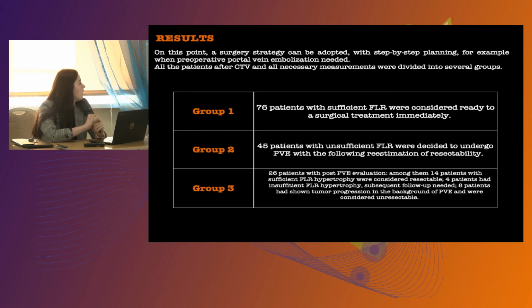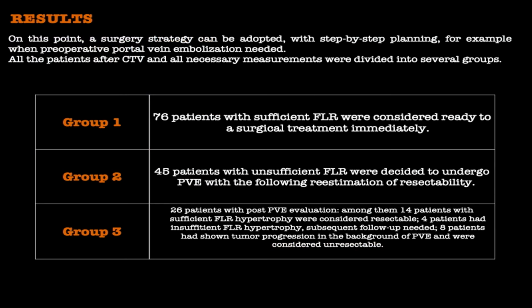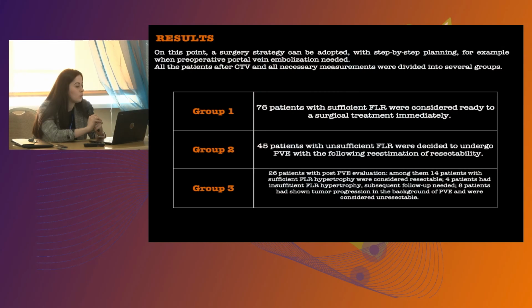All the patients, after our volumetry and all necessary measurements, were divided into several groups. Following re-estimation of resectability. And in group 3, we had 26 patients with post-portal vein embolization evaluation.